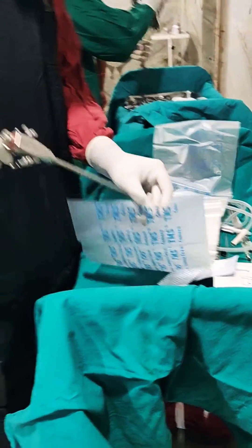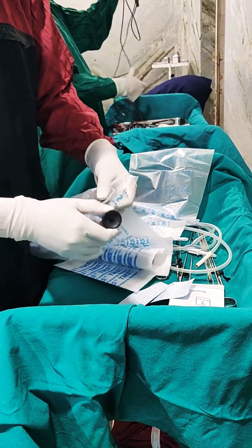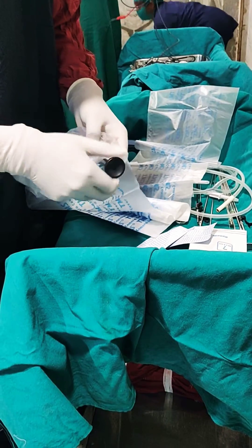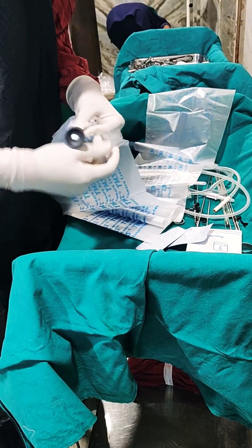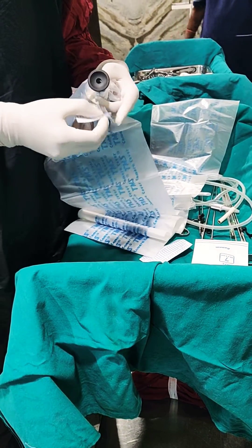I open the camera cover, I first put my scope inside the cover and I will wrap it around at the very base. I will seal it with an adhesive tape which is also sterile.